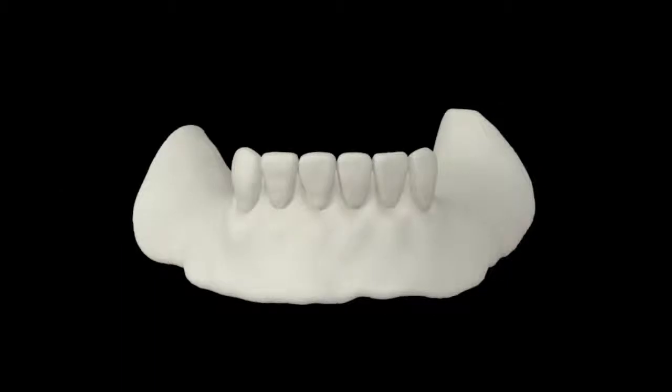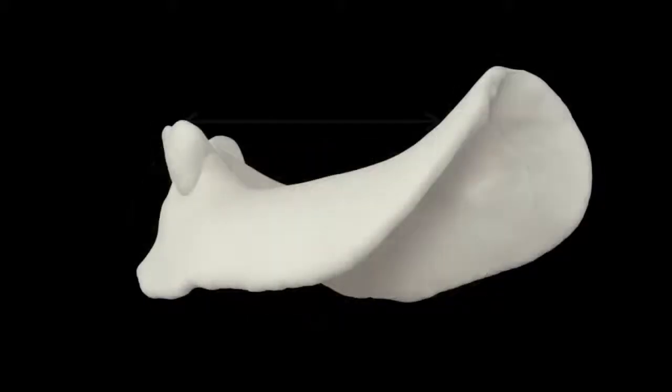For the mandibular guide, the anterior six teeth are positioned with the incisal edge 18 mm from the vestibule. A line that extends from the incisal edge to halfway up the retromolar pads is used to establish the occlusal plane.